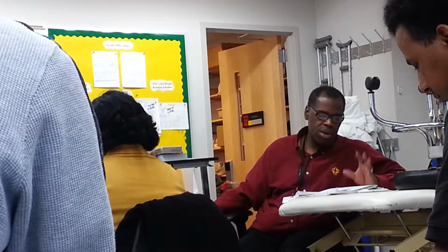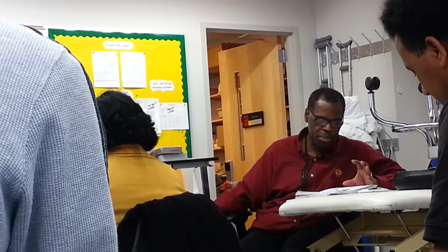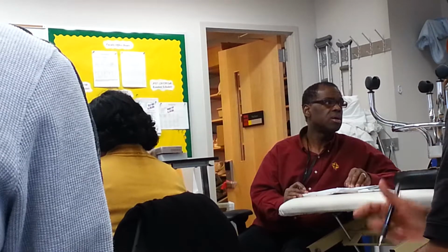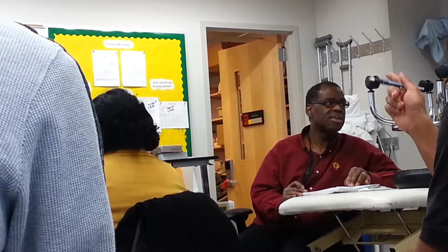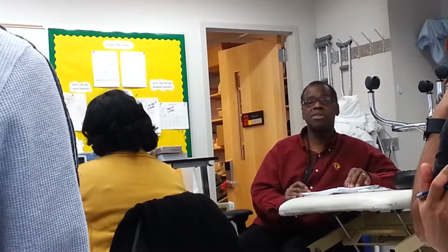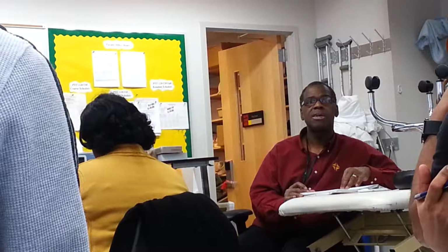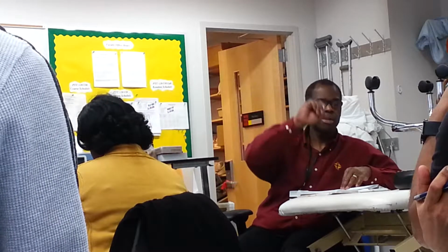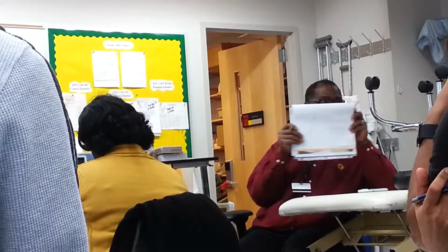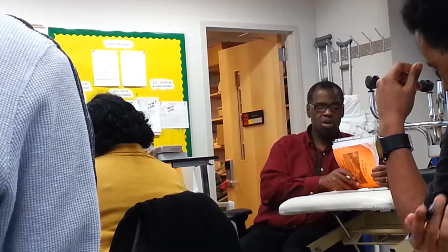So, I know how to treat for a monophasic problem. Now I want to move to a biphasic problem. What does that mean if I'm choosing a biphasic machine? It's two polarities. What are the polarities? Negative and positive. They're on together, and they result in a circuit, a current with zero net charge. Neutral charge. So there's no charge accumulation.